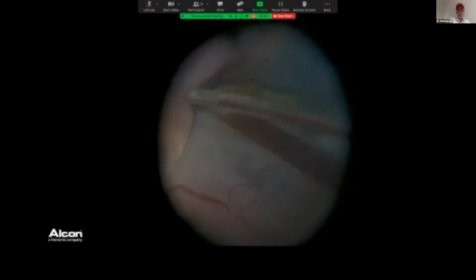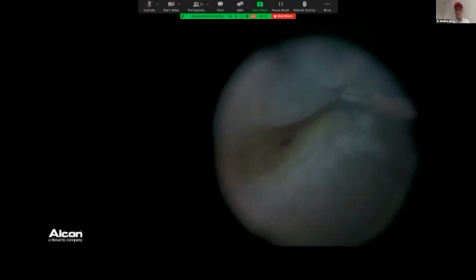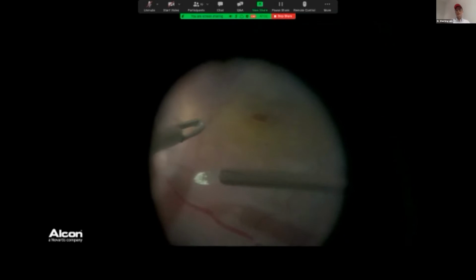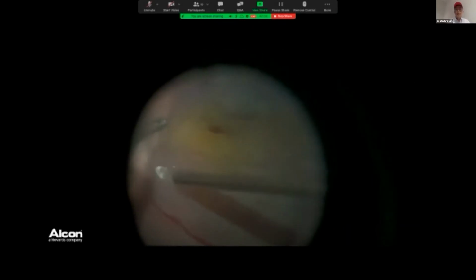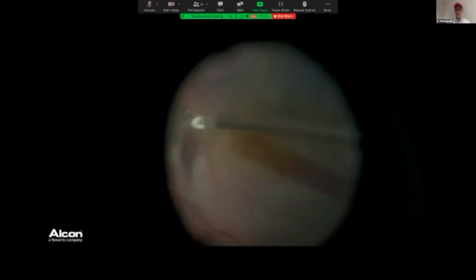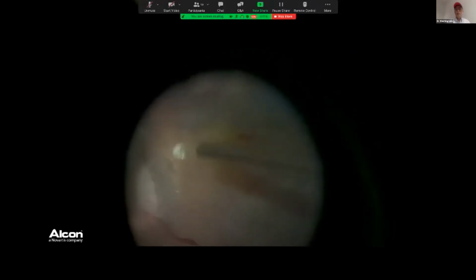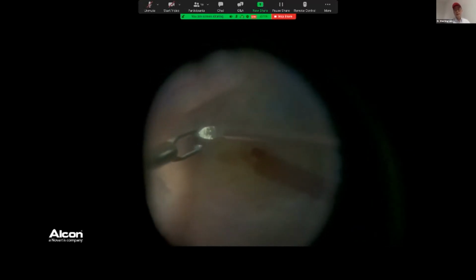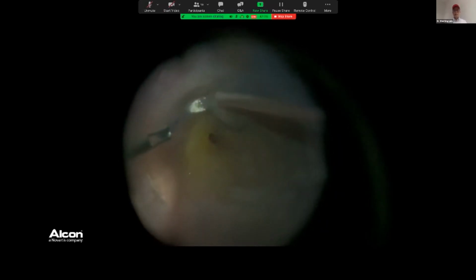So after you peel the vitreous membrane, I stain the ILM, and here I'm peeling the ILM. Again, trying to do it with a single-handed forceps, I found that as you pull, the bullous detachment will come with it, making it difficult. So again, a bimanual method using a diamond-dusted membrane scraper or the Finesse loop will be helpful to scrape off the very adherent, in this case, internal limiting membrane. But remember, as I mentioned, they often have multiple layers of vitreous membrane before you reach the internal limiting membrane.